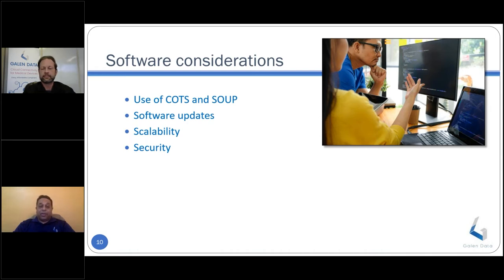And then software design choices. You have to carefully understand how those software design choices will ensure scalability and availability, specifically if availability is a key goal in your connected journey. So if you need the data to be available at all times, then you need to make sure that your design is achieving those availability goals. And then always, because you collect data, security of data and integrity of data must be maintained. Some architectures are better suited at this than others. Specifically on the cloud side, a lot of stateless architectures allow you to enhance scalability and provide more resilience against failures.